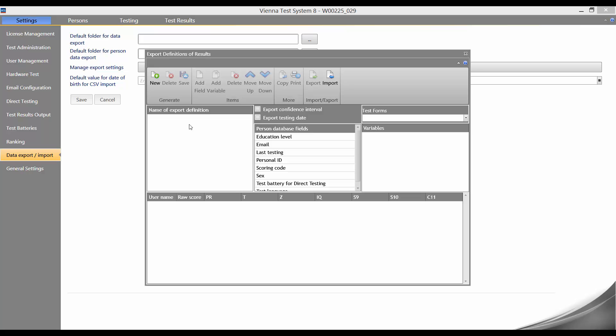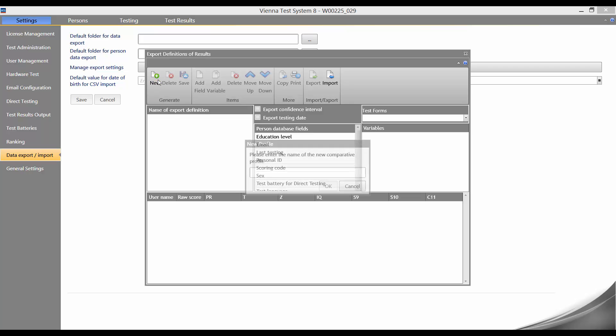To do this, we click on new and enter a name for our export profile. We name our export Stroop S10 profile and confirm this with OK.